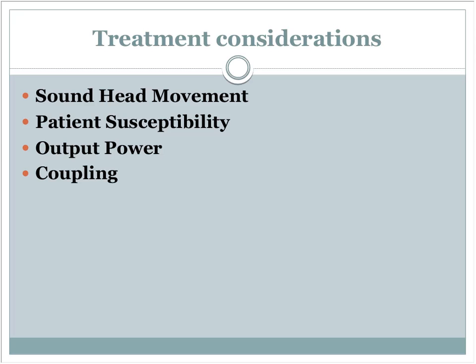The other thing is putting too much gel. If you glob a whole lot of gel on there, you're dispersing the sound waves out through that whole mass of gel. You want to be able to put enough gel on so that you can slide the sound head very evenly, smoothly over the area of treatment without it kind of catching and rubbing, but not so much that you're pushing a large amount of gel around.